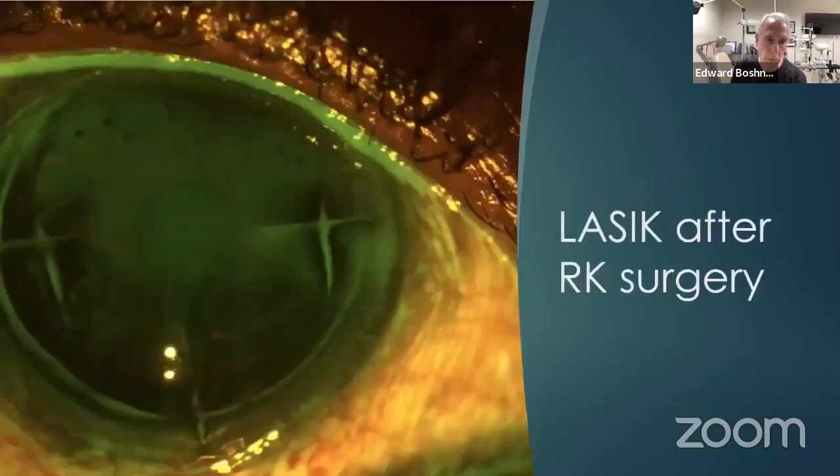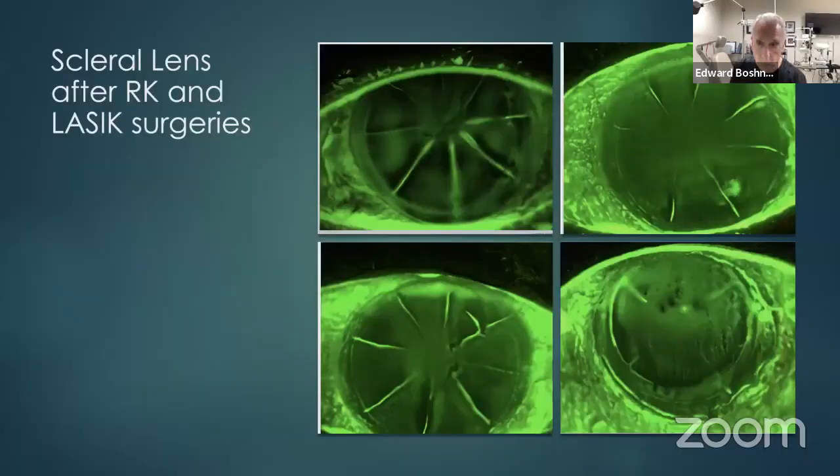Here's another eye that underwent RK surgery, followed by LASIK surgery many years later. I've never seen anyone who had multiple surgeries come out on top of this. Usually what they call enhancements make things worse. There are multiple corneas of eyes that underwent LASIK surgery after RK surgery. All of these people needed scleral lenses, all of them.